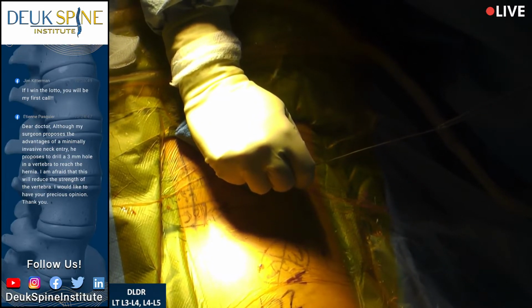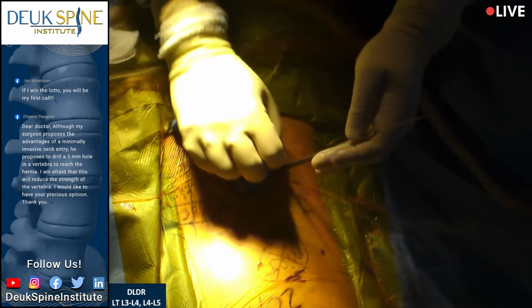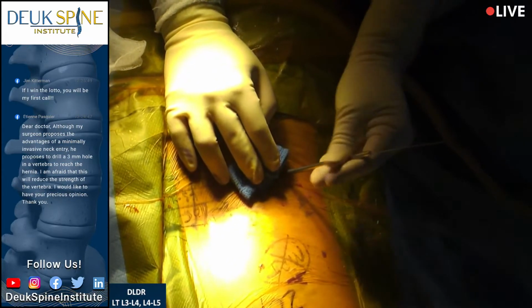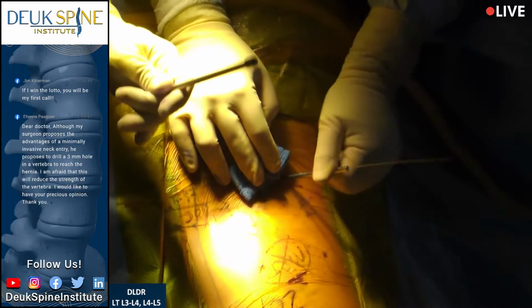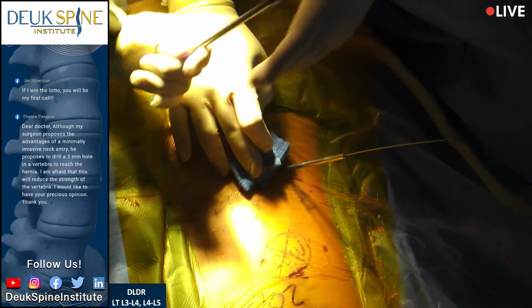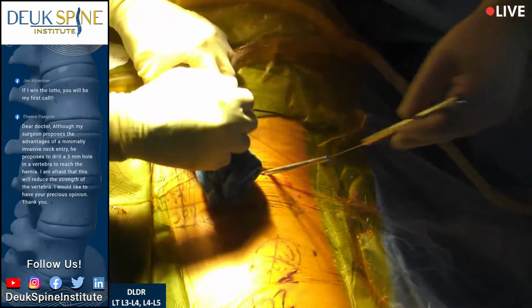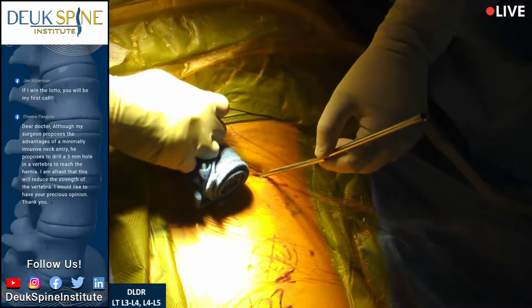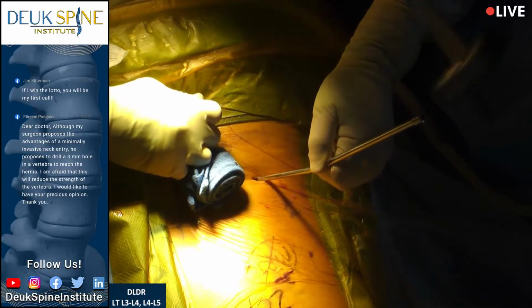The reason I'm struggling to get the dilator on there is because she's breathing up and down, so it's kind of moving it. But I like challenges. Luis knows that. He knows better than to try to help me. He also knows I get it eventually, right? Yeah, of course. All right, a little pressure here. Yes, sir. So we're finished treating the L3-4 disc, and we're now going to be moving on to the L4-5.